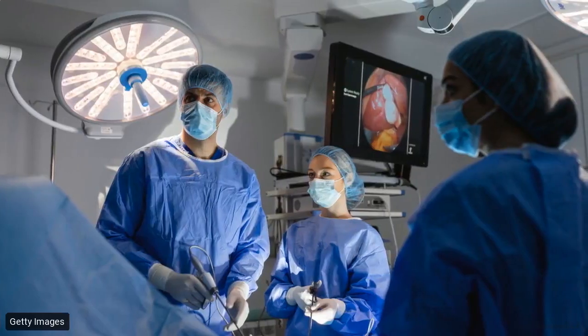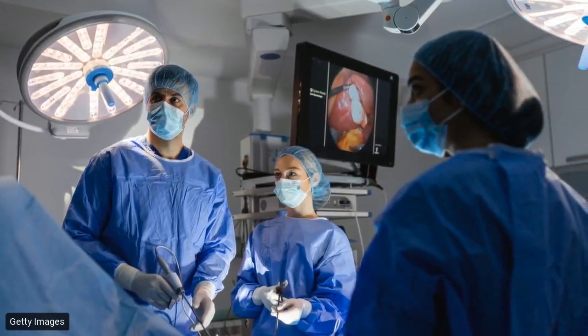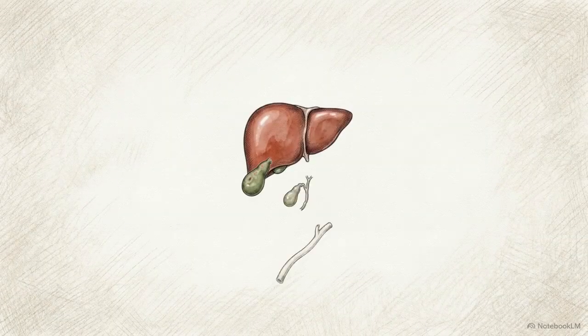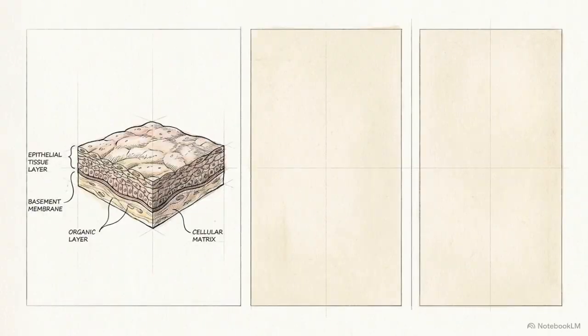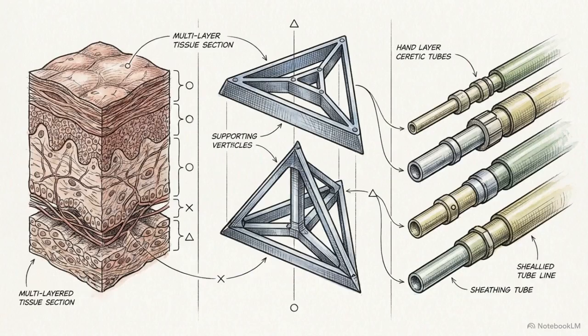Moving these spatial, temporal, and relational architectures out of the lab and into the operating room shifts the objective. The algorithms must now provide high-stakes clinical decision support. A prime application for this is the critical view of safety, or CVS. It is a universal visual heuristic used during laparoscopic cholecystectomy to prevent severe bile duct injuries. To safely proceed, a surgeon must meet 3 strict anatomical criteria: expose the cystic plate, clear the hepatocystic triangle of fat, and isolate 2 visible tubular structures.